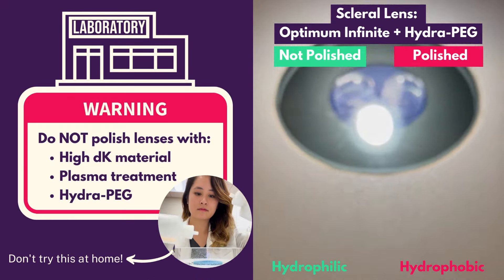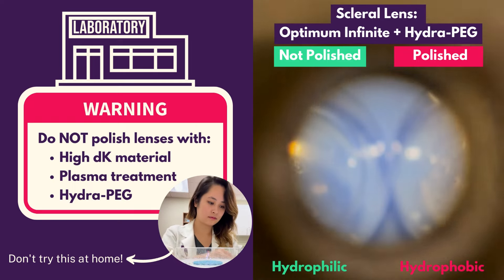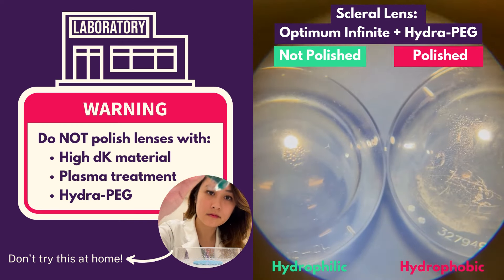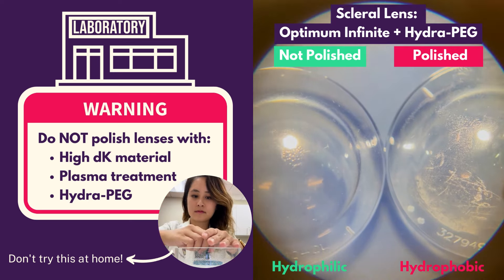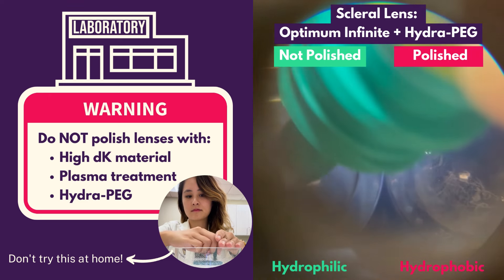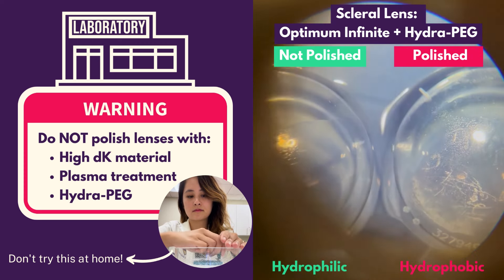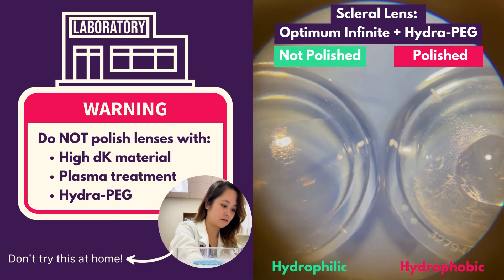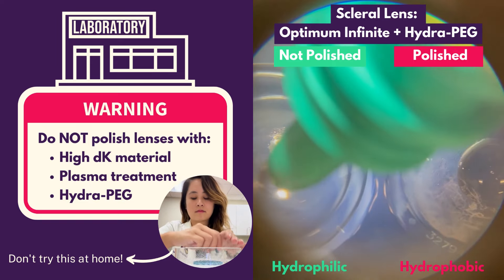Other don'ts: don't polish lenses made from high-Dk material, as they are very soft and susceptible to surface defects. Polishing will also strip plasma-treated or Hydra-PEG coated lenses. To satisfy curiosity, I have done all of the above. These identical scleral lenses are made from high-Dk Optimum Infinite material with a Hydra-PEG coating. On the right lens, the condensation highlights the micro-scratches from the polishing, not seen otherwise. The lens is also much less wettable, completely repelling the water droplet.